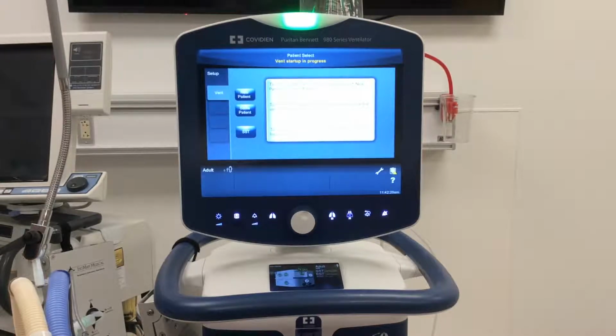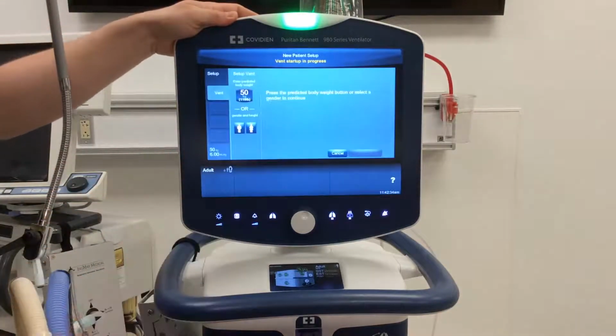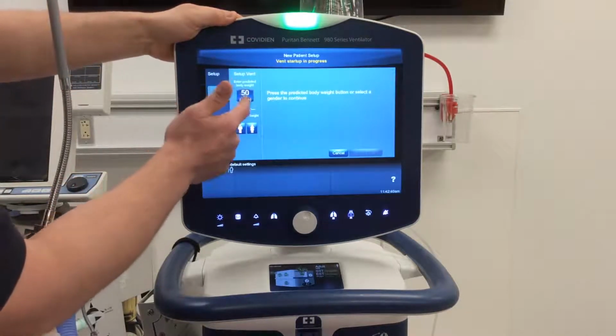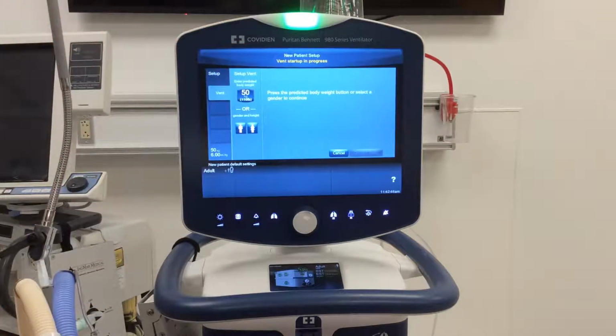So that's why it's not giving me the option to change anything. I'm going to go to new patient. It is a touch screen. So when it brings this up, and we kind of talked about this a little bit, it gives you the option of either putting in that patient's predicted body weight, or ideal body weight is what we call it. So if you happen to already know that, you could input that there. However, most people do not know.